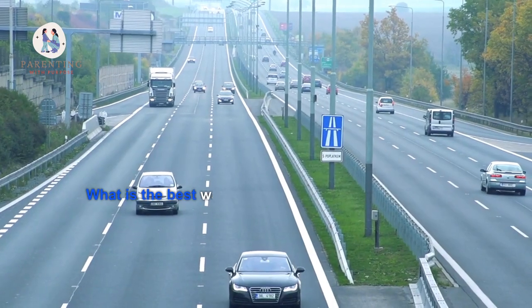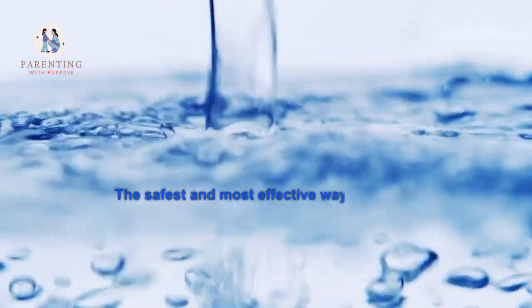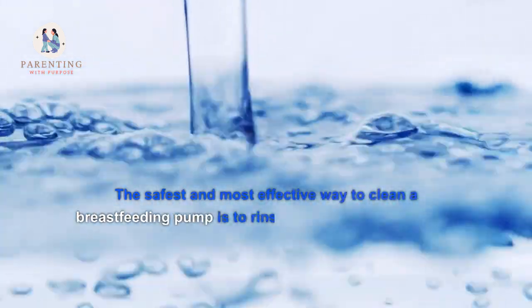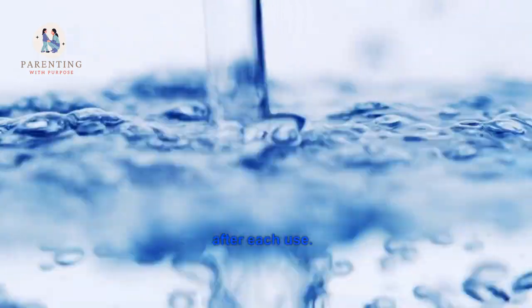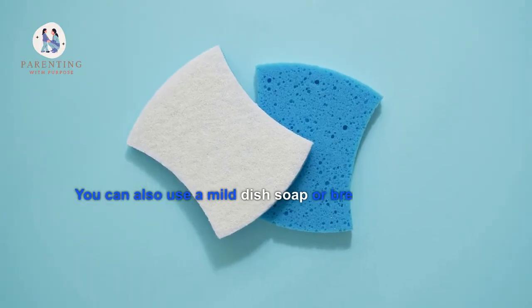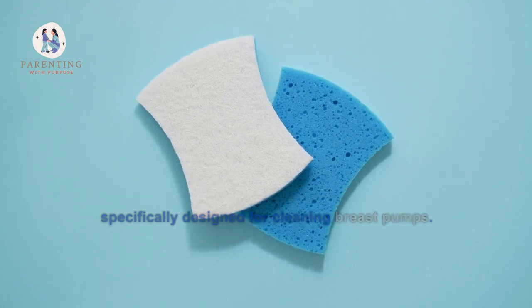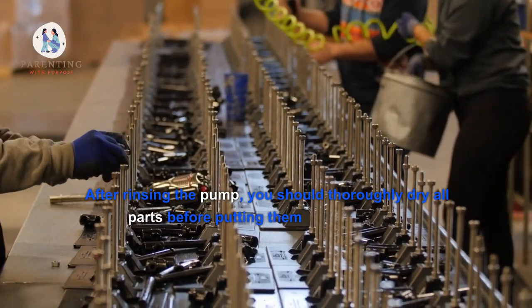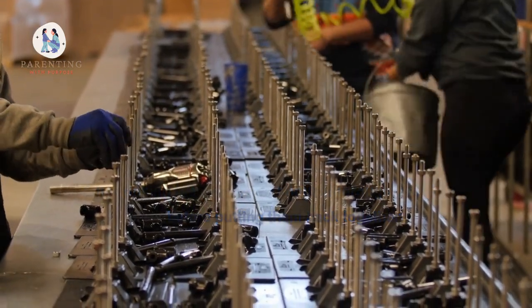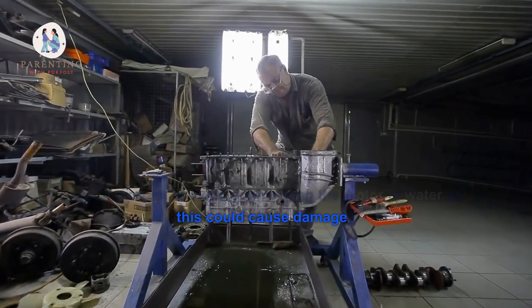1. What is the best way to clean a breastfeeding pump? The safest and most effective way to clean a breastfeeding pump is to rinse it with warm, soapy water after each use. You can also use a mild dish soap or breast milk cleaner specifically designed for cleaning breast pumps. After rinsing the pump, you should thoroughly dry all parts before putting them back together. It is important to avoid submerging the motor in water as this could cause damage.